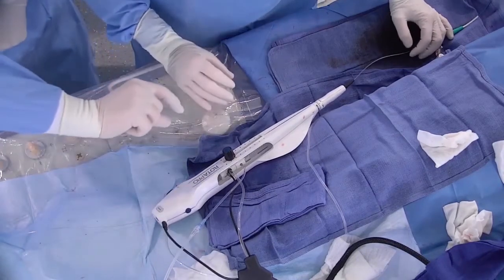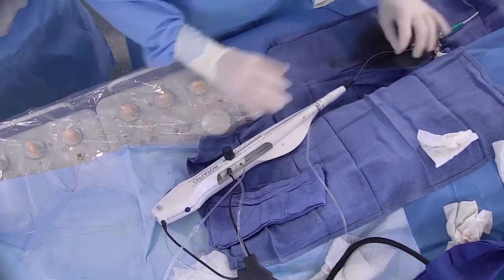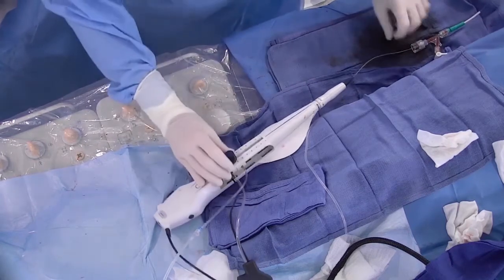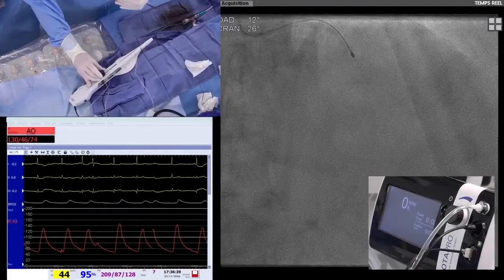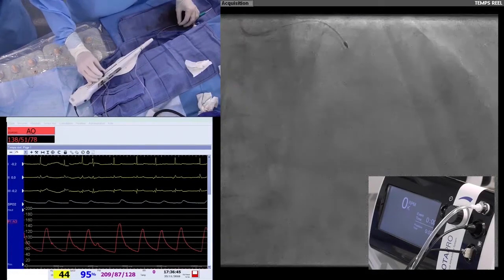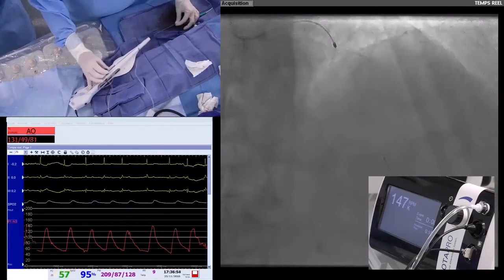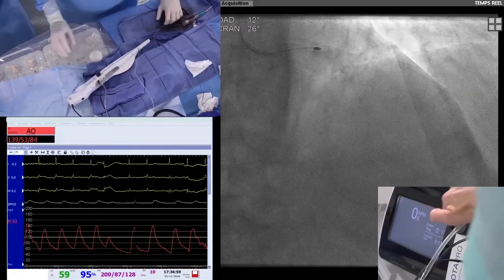So basically, you don't break it, right? No. You don't fix it. You let it open. Yeah. And thanks to that, you can advance it slowly, more distally. It's a trick. Sometimes, especially in distal RCA lesions, it's difficult to advance the burr distally. I do that after crossing the proximal lesion, of course. And thanks to that, I will go more distally, as you can see, very easily. Now the sound is very good. It looks terrific. And I think we will now place the workhorse guide wire.